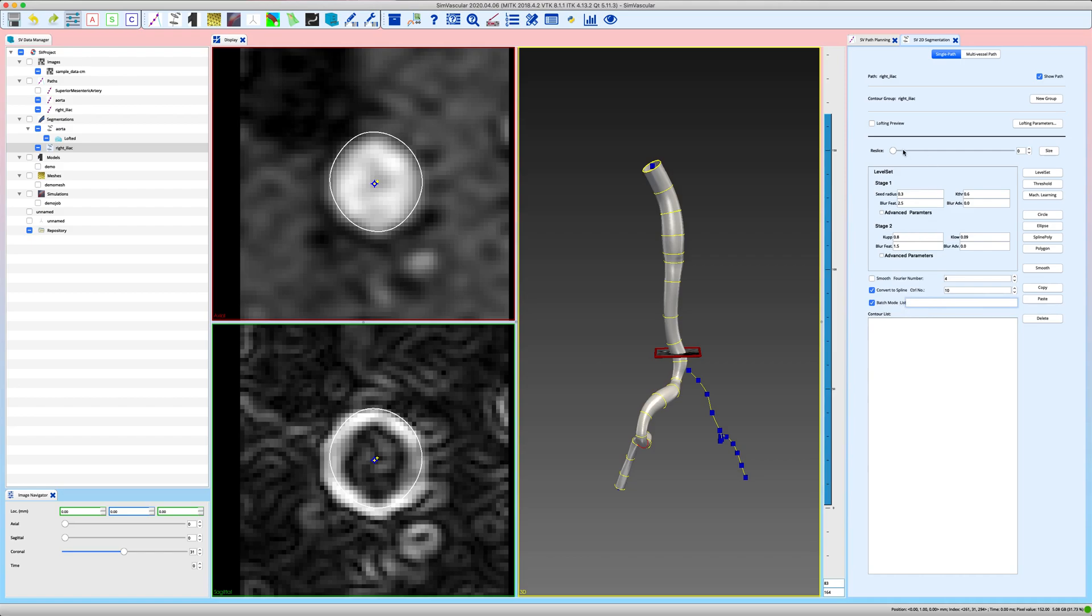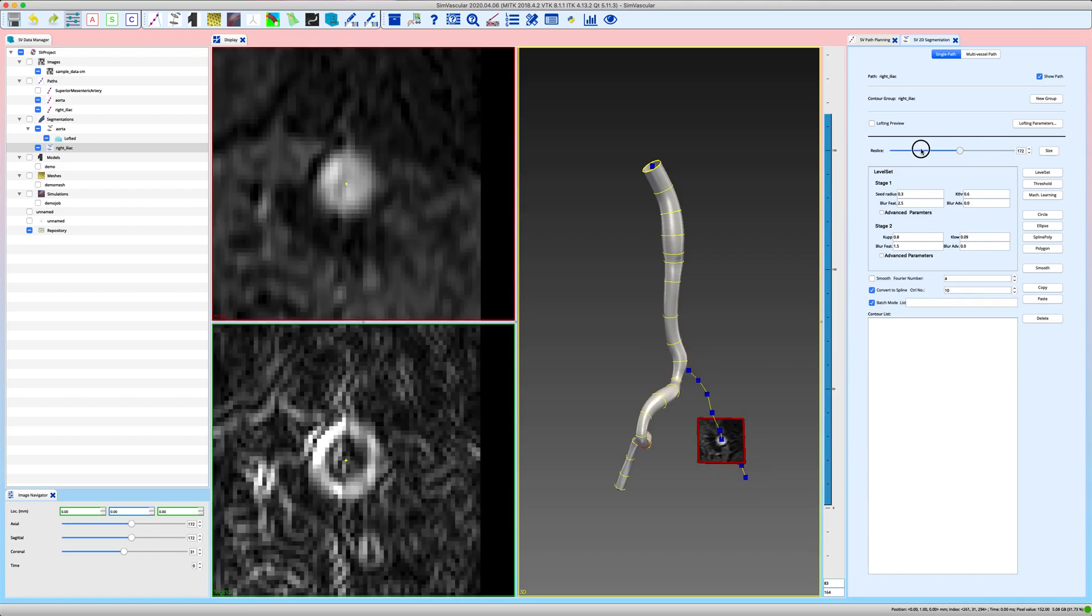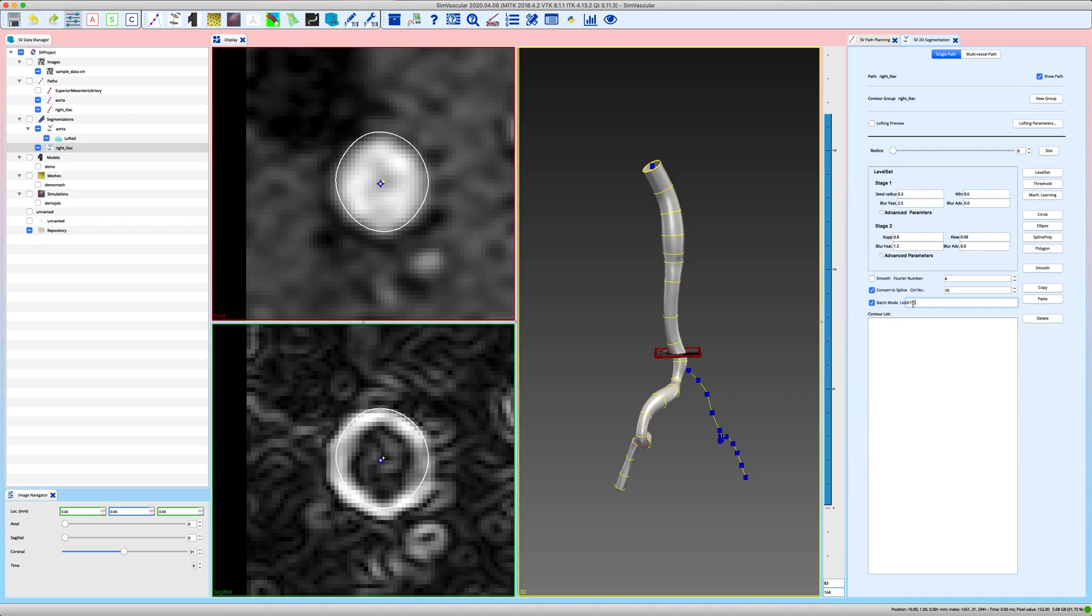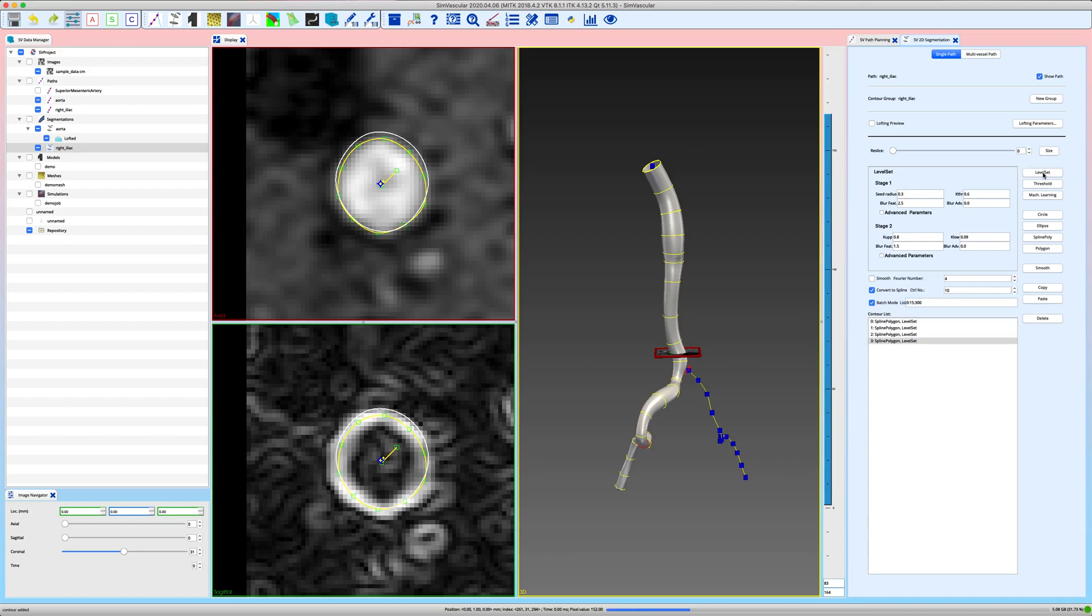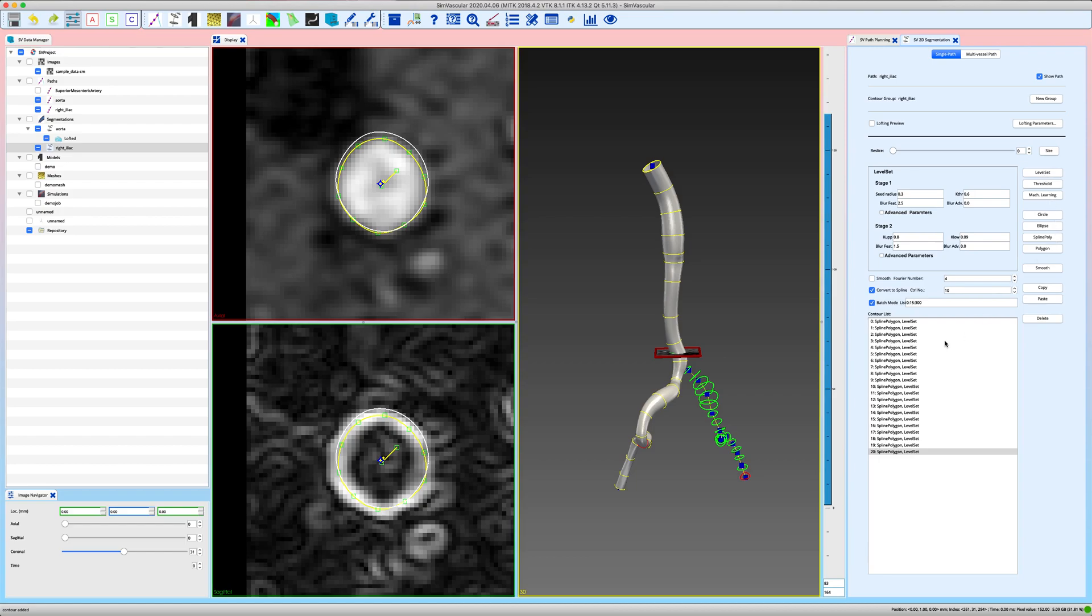Let me just try again the batch mode. How long is our path? It's got 304 slices so I will start at zero, in increments of 15 until 300, and see how that is doing.